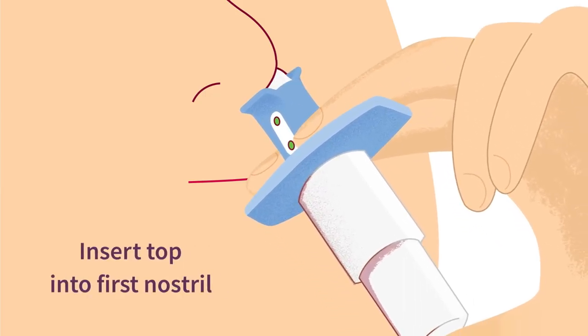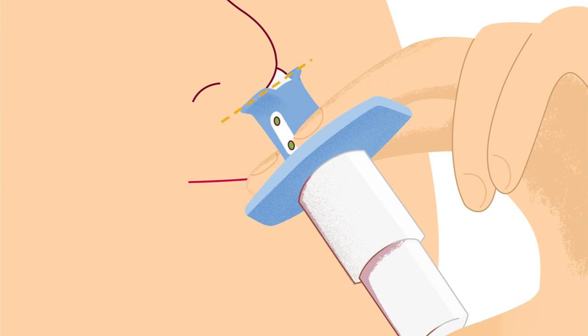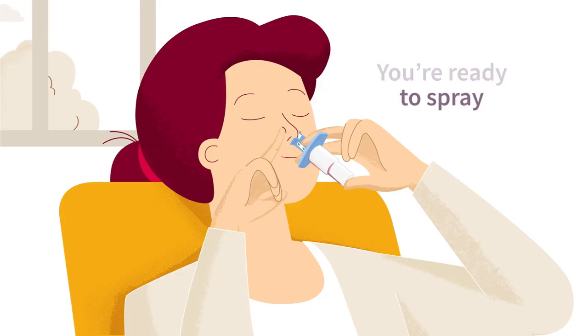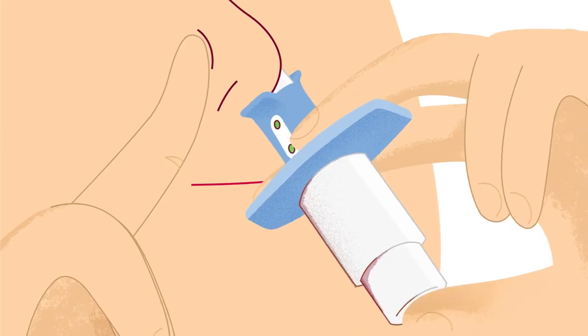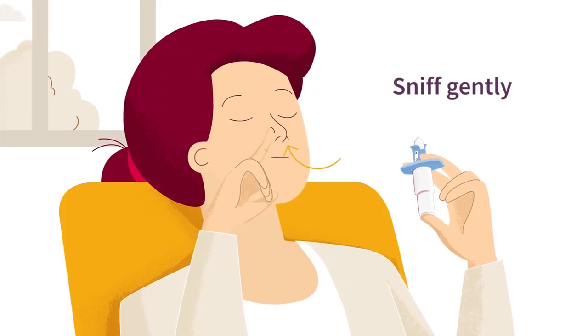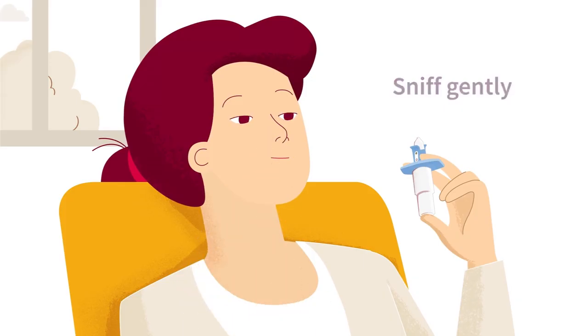Next, insert the top into your first nostril like this. The nose rest should touch the skin between the nostrils as shown. Before you spray, use your finger to close the opposite nostril. Now, breathe in through your nose while pushing the plunger all the way up until it stops. Sniff gently after spraying to keep the medication inside your nose.